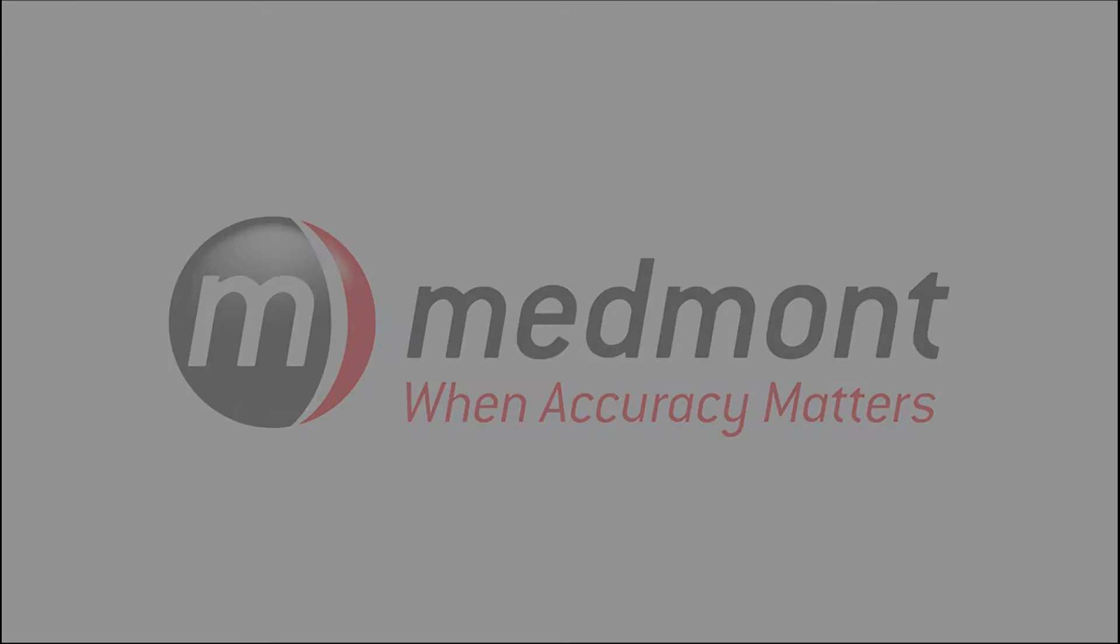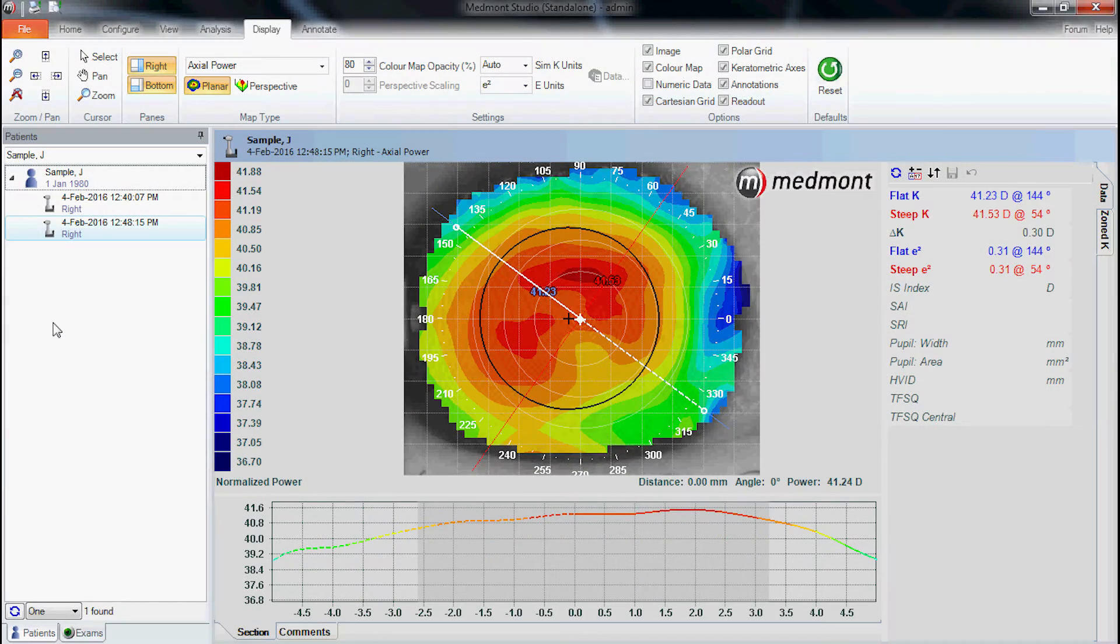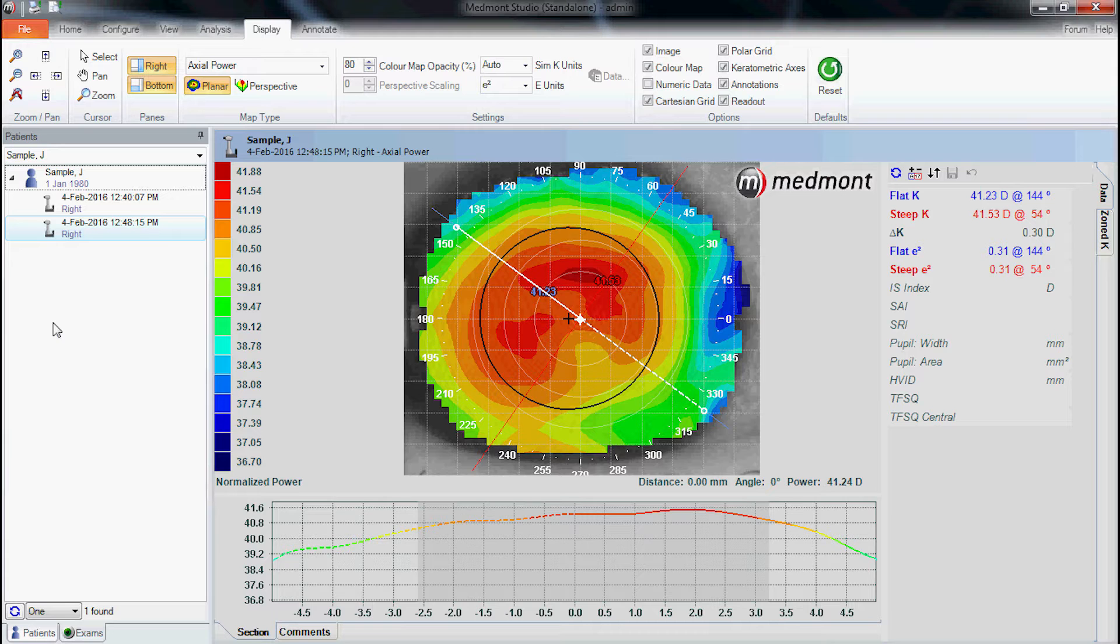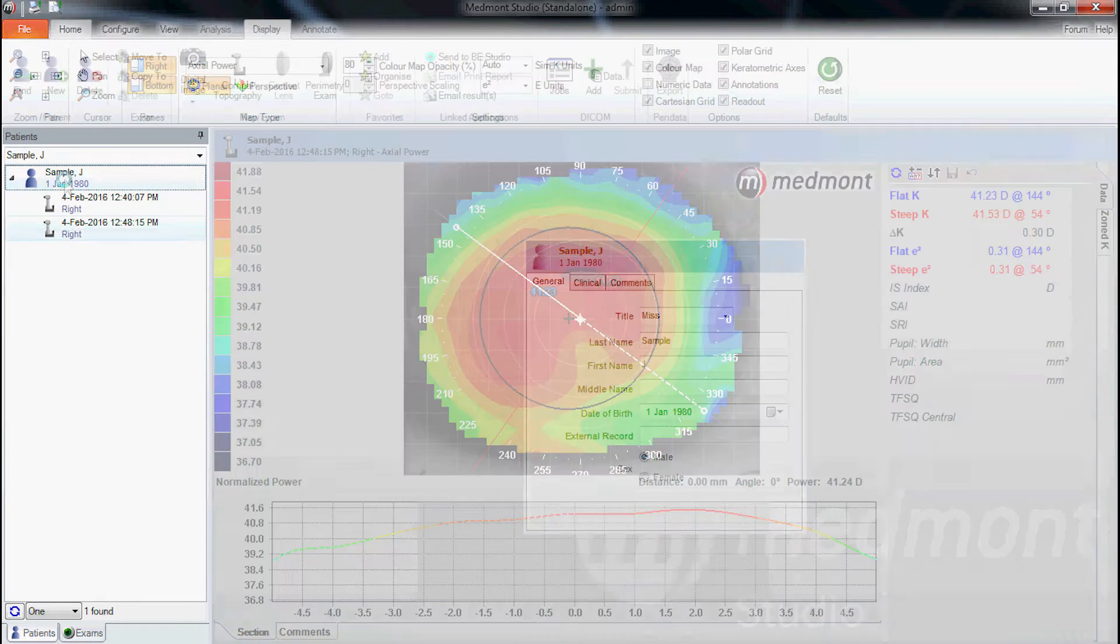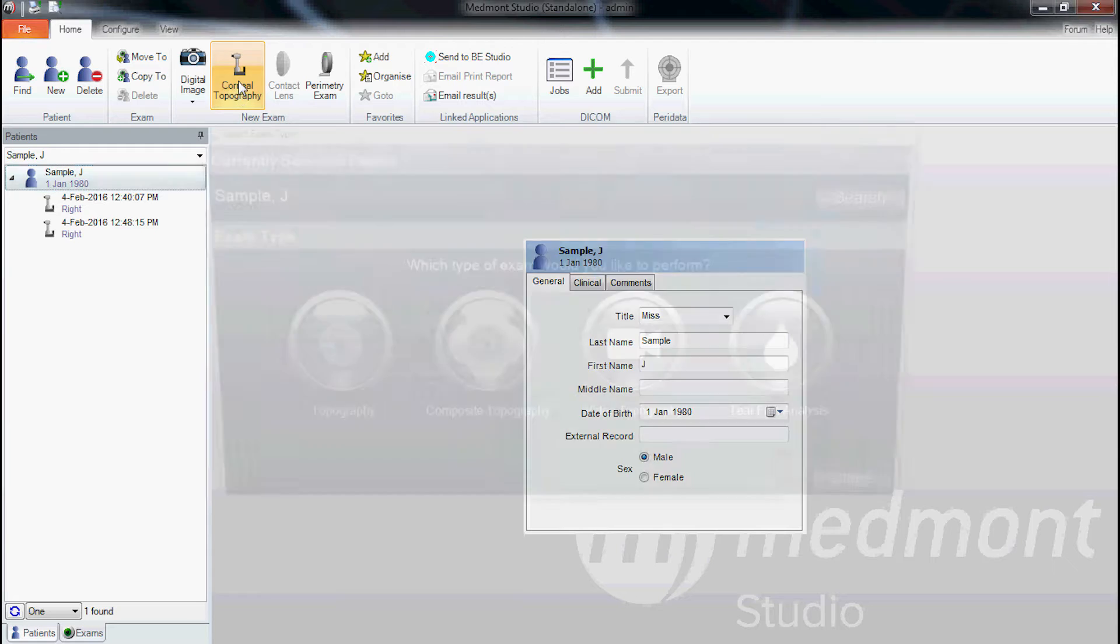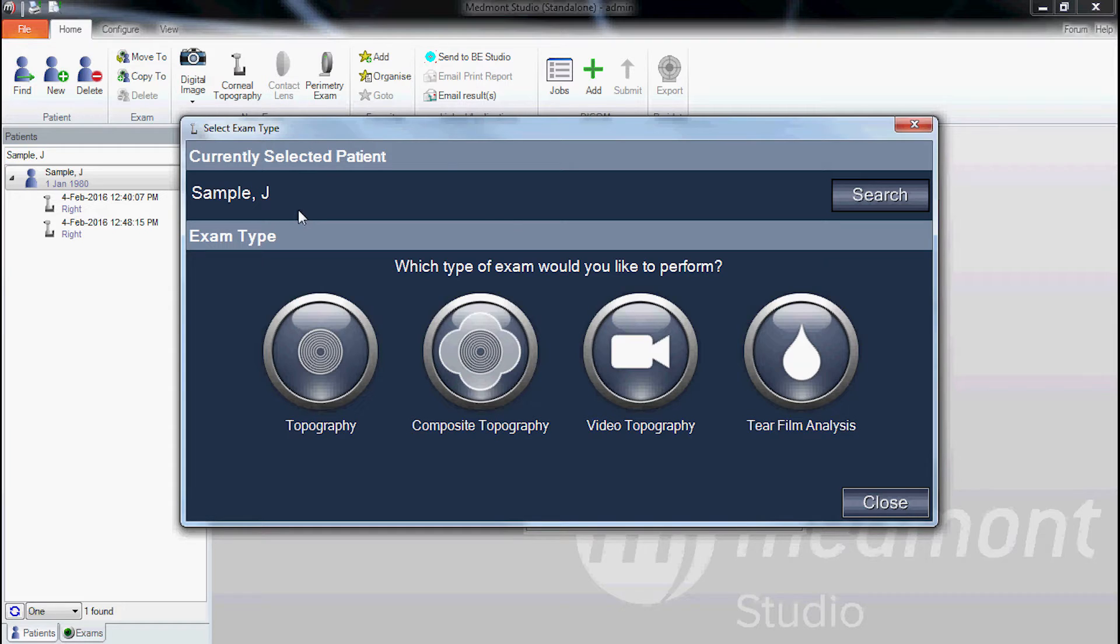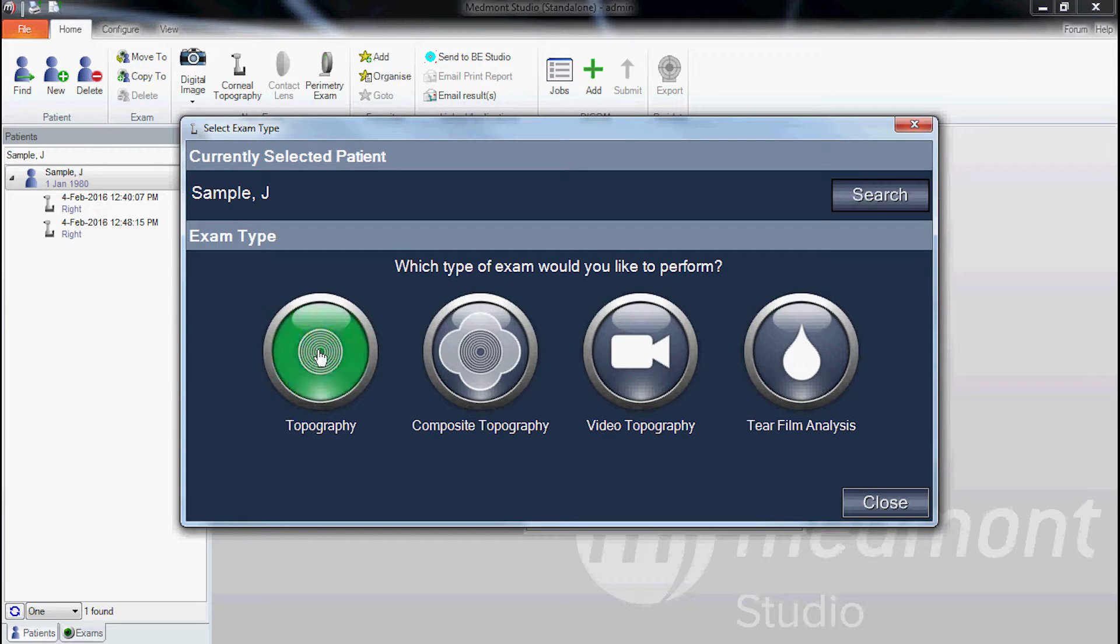This video describes the capture process with the Medmon E300 corneal topographer. Start by clicking on the patient name and then go up to the corneal topography capture icon. This brings up a window that allows you to image the eye multiple different ways. In this case, let's choose the single map capture and click on the topography icon.